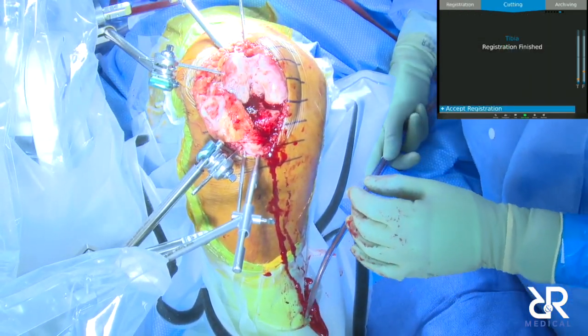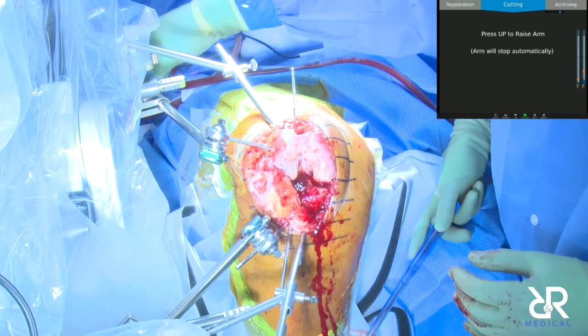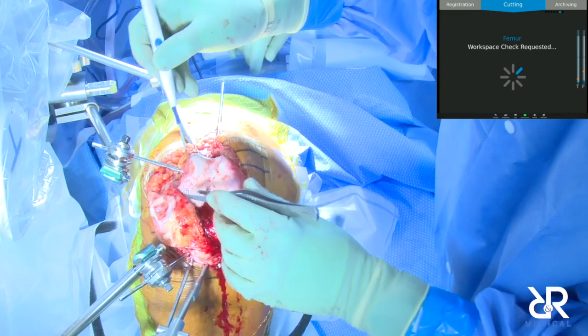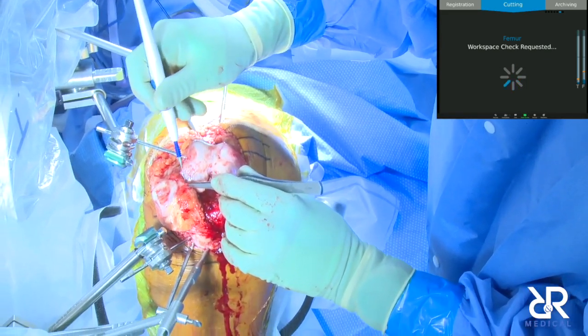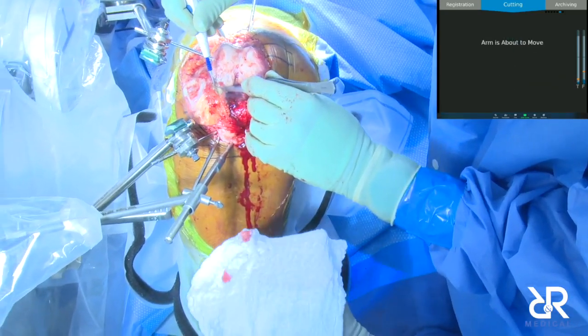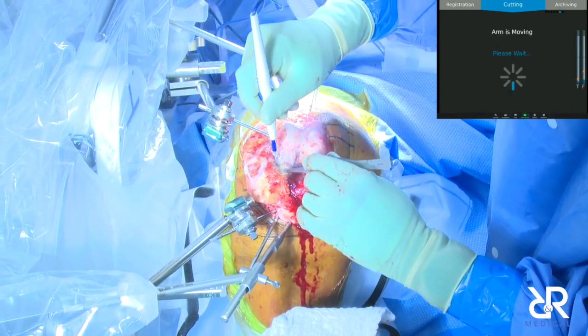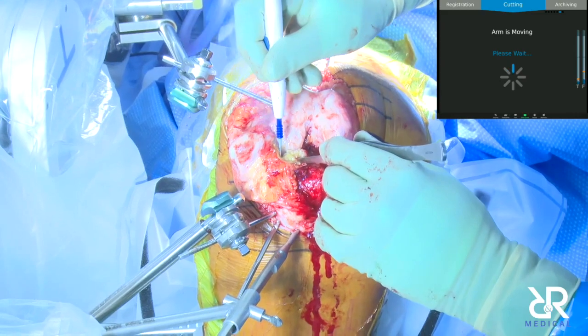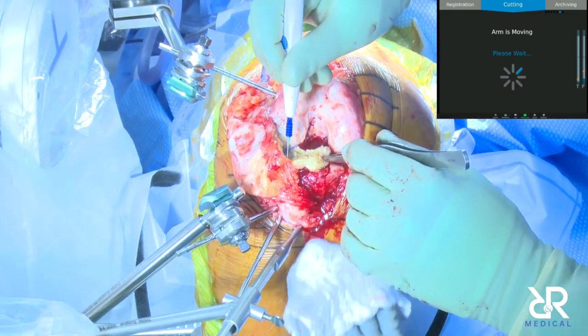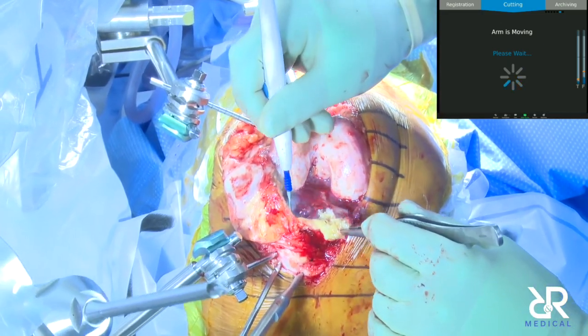All right. Ready to rock and roll? So now, while the robot comes in, I'm going to clean up a little bit more in that posterior lateral corner, take out a little bit of the fat pad. Obviously, you want to be really careful nothing is moving, right? Because then you have to start over.